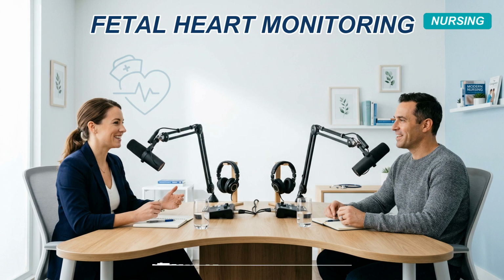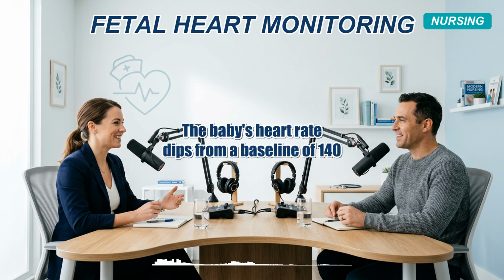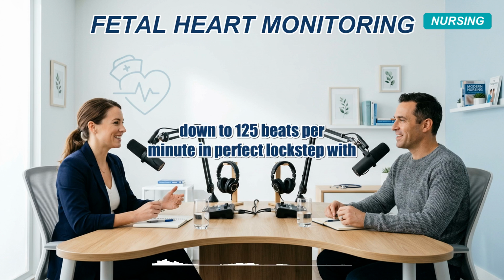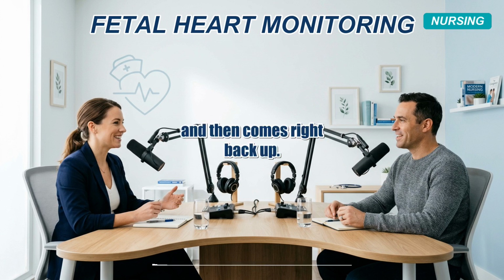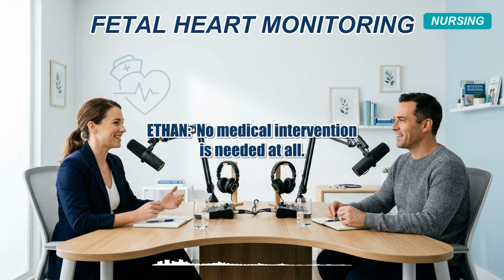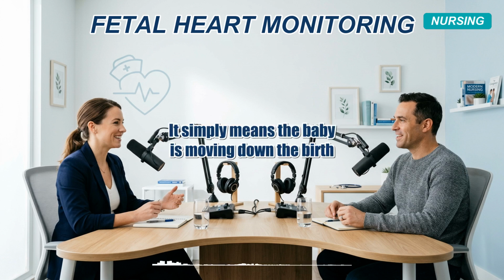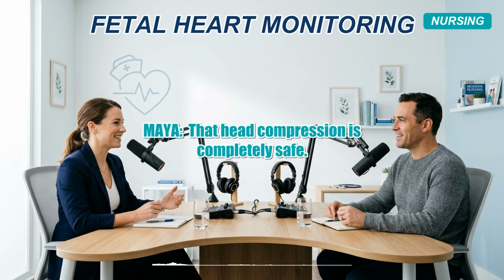It's a great example. Imagine a patient who is 8 centimeters dilated, deep in labor. The baby's heart rate dips from a baseline of 140 down to 125 beats per minute in perfect lockstep with the contraction, and then comes right back up. Right, and the nurse watching that monitor doesn't panic. No medical intervention is needed at all. It simply means the baby is moving down the birth canal. That head compression is completely safe.